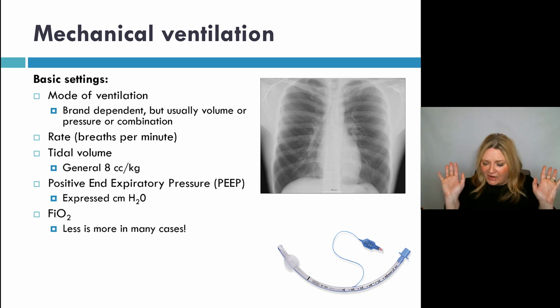FiO2, again, you all know FiO2, the fraction of inspired oxygen. In general, less is probably more in most patients. It depends on the patient, but we shouldn't be blasting everyone with 100% oxygen. You really should titrate that to a specific oxygen target.